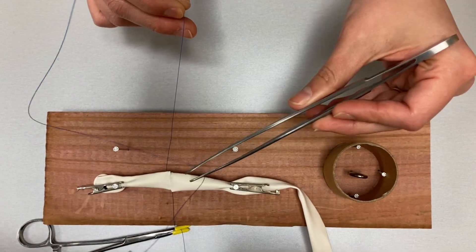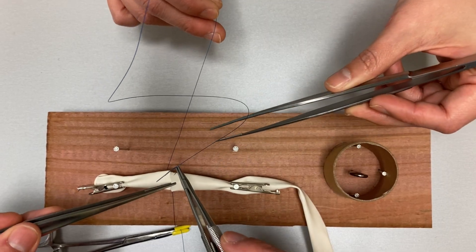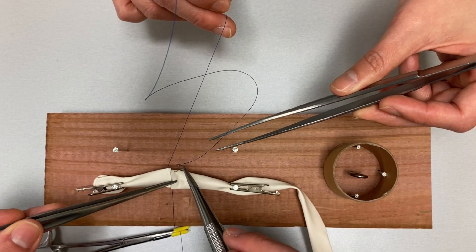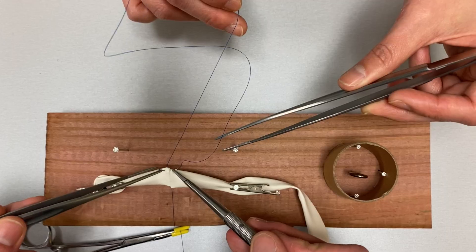Now using the opposite end of the suture, load the needle forehand and begin to sew towards yourself. Take the stitch in one if you are able to.